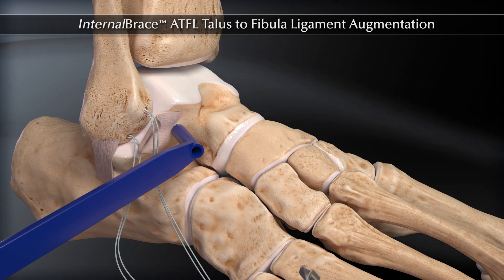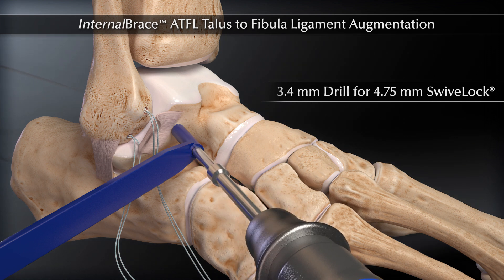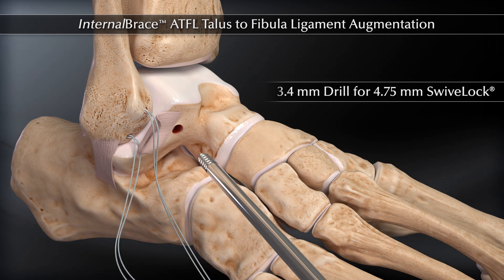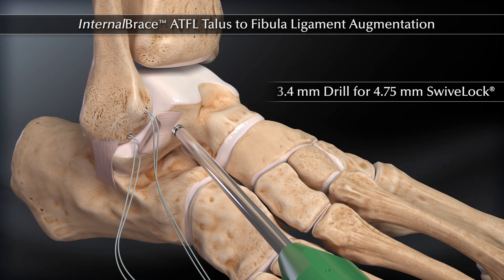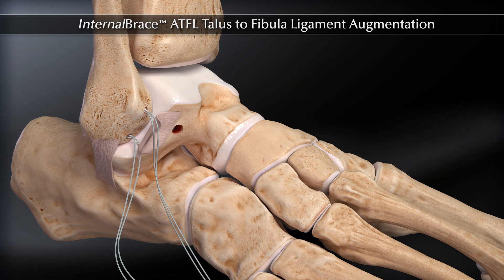Prepare the talus by drilling with a 3.4 mm drill and 4.75 mm tap on the non-articulating surface of the talus. Add a 30-45 degree angle into the body of the talus so as not to aim toward the joint space. Drill parallel to the bottom of the foot.